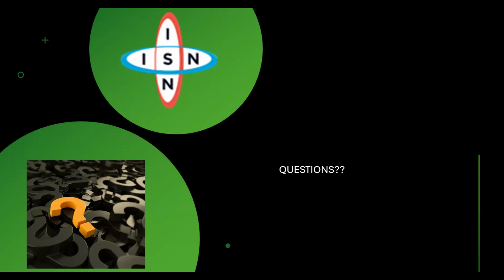Yeah, good. You can go ahead. We have a maintenance log, and daily, obviously, you should clean the analyzer to prevent any blood, just the peripheral surfaces of the analyzer, with probably just a little water on maybe a rag, and then perform your daily checks, obviously.